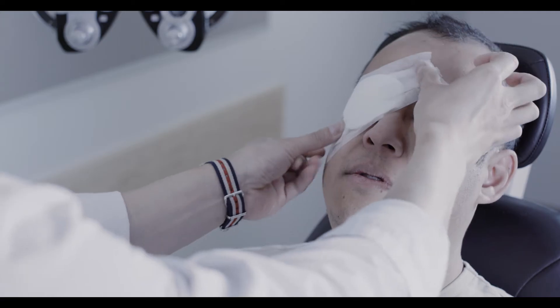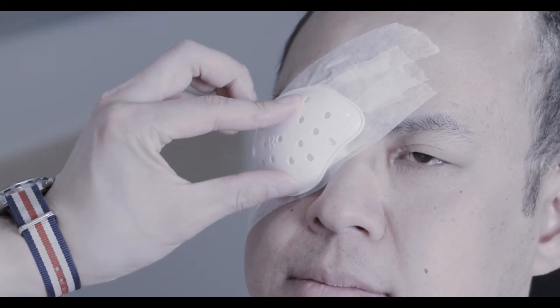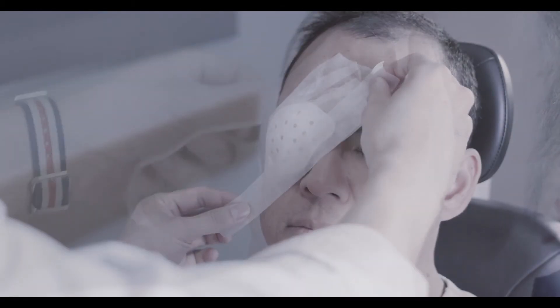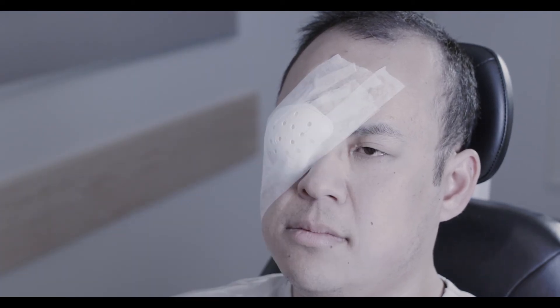Ask the patient to keep their eyes closed during this step. Just to double check — your eye is still closed underneath the patch? Yes. An eye shield can be positioned over this patch if desired. When transferring patients with a suspected globe injury, only a shield should be used, as this allows protection of the eye without applying pressure to the site of injury.